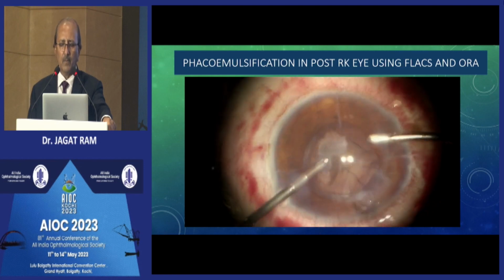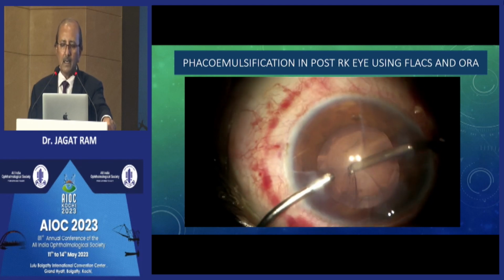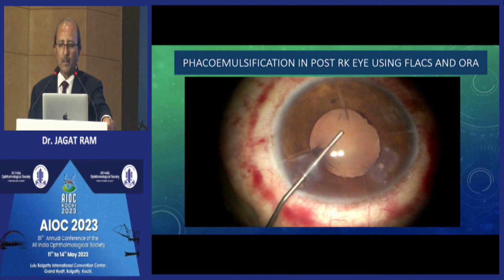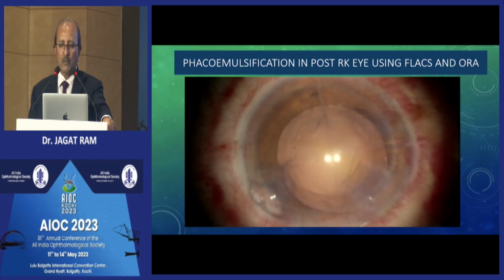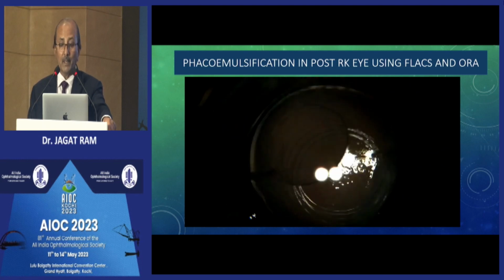Again, this procedure remains the same for any type of eyes, but particularly in radial keratotomy, particularly if there is a central haze, a corneal opacity in the center. In this patient, it is a clear visual axis, so no issue, no problem found, but otherwise it may not even measure it.